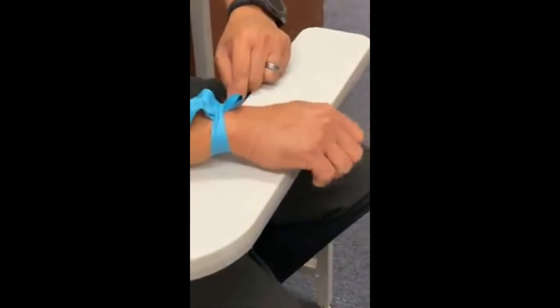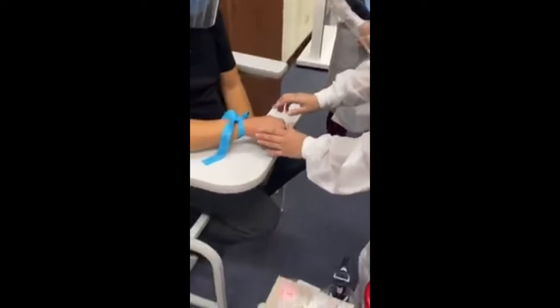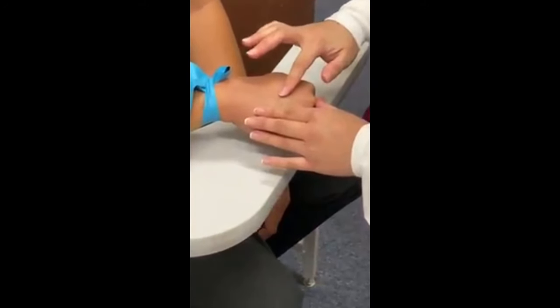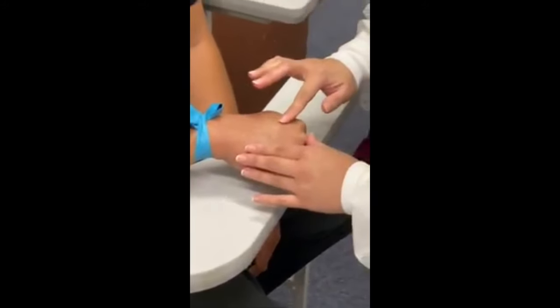Okay. And then, did you want me to hold here, or do you want me to make a fist? It's up to you. Can you just make a fist for me? Okay. This looks like a good vein. Okay. All right. So now I'm going to prepare the equipment.